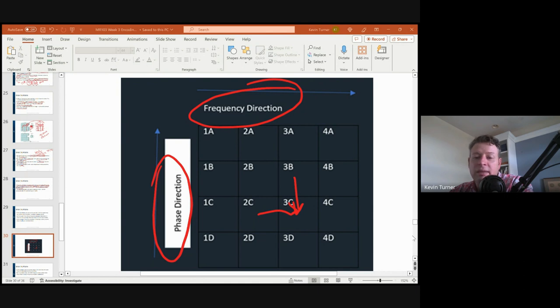Yeah, COPD patients can be really hard, especially when you're doing abdomens because they have to hold their breath. Yeah, I change all my parameters too. That's how I scan, because my kung fu is better than everybody else's. Then you become the lead tech, and you get to save all your parameters in the scanner. So when you open it up, it runs the way you want it to. That's part of being the lead tech. Everybody's got to mess with your parameters, because you can save parameters.